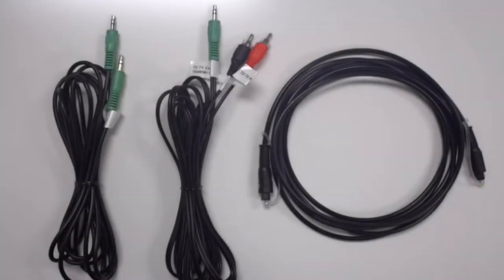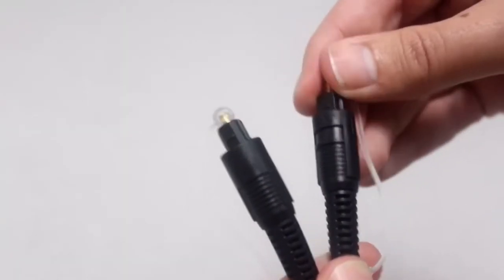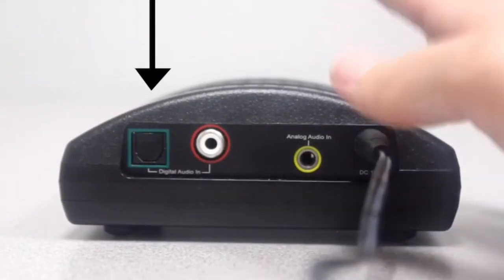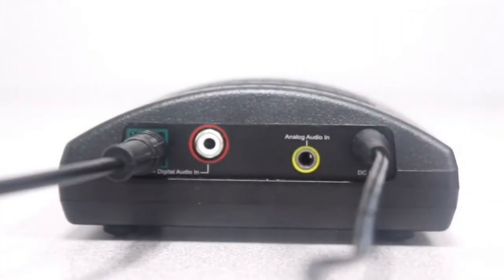Don't be alarmed by all the different wires that are included — you will not need all of them. In the end, you only need the AC adapter and one audio cord. If you own a digital TVEUR and have a flat-screen television, the majority of the time you'll need to plug in using an optical cord. This cord has a single black end on each end. First, remove the clear caps off of both ends of the optical cord. Second, plug either end of the cord into the TVEUR transmitter where the green square is, labeled as digital audio in. The cord only fits in one way, so don't force it in.